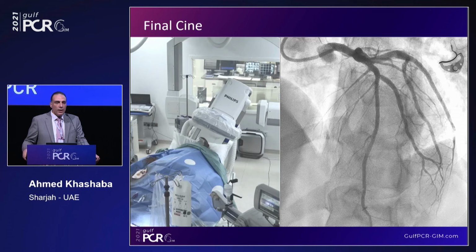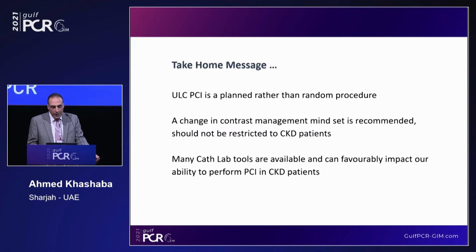Make sure that you are avoiding any complications, making sure that the side branch is okay and everything is fine, so you can discharge the patient from the cath lab.